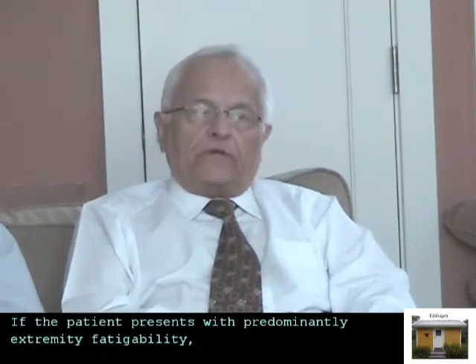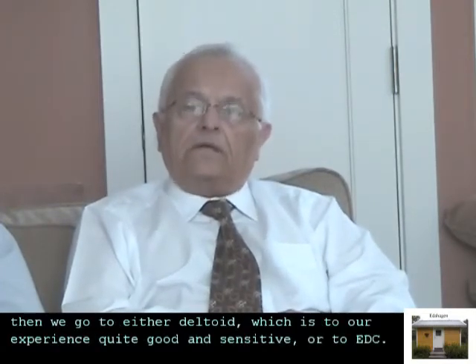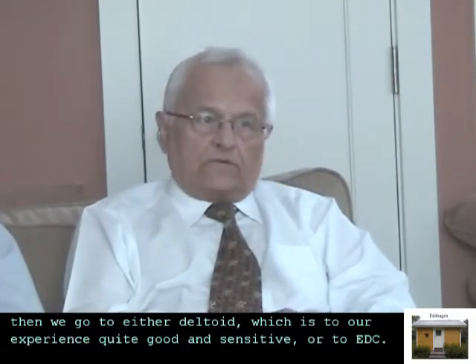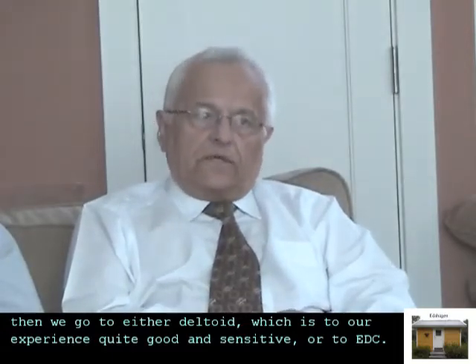If the patient presents with predominantly extremity fatigability, then we go to either deltoid, which is, to our experience, quite good and sensitive, or to EDC.